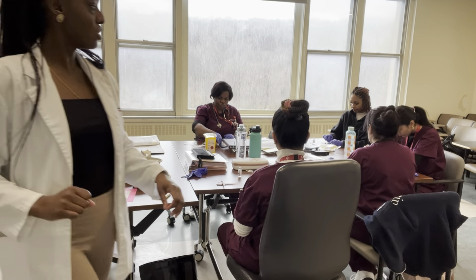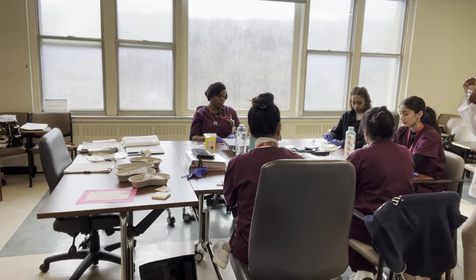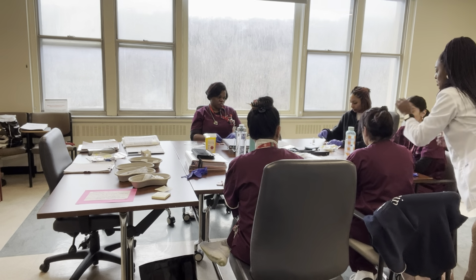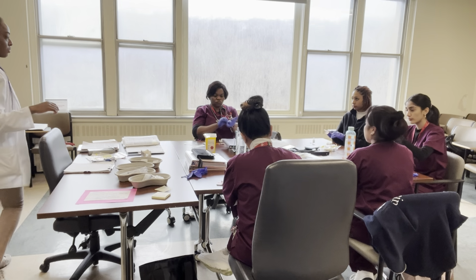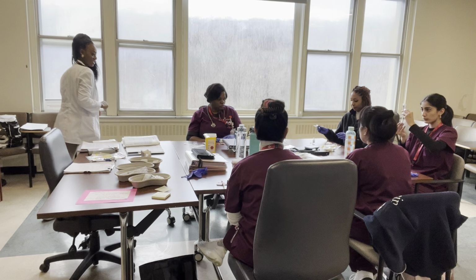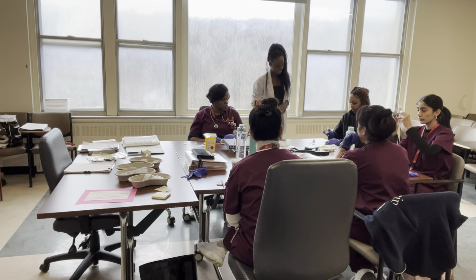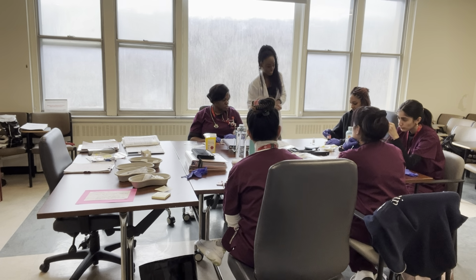So, Jasmine, when we mentioned that we're not gonna have the needle up in the air without the cap on. Keep the cap on the next time. It's okay, just for the next time, because in case she puts her hand up to grab, she doesn't get poked. Good? Yes. No problem. Okay, so ready for the three of you? So one at a time? One at a time, I'll start with you. So you clean? I clean. Okay, open. Okay. I'm gonna hold and I'll go in. So you let them know. You need to let your patient know I'm gonna go in. And so they're aware, sometimes they freak out. Okay?